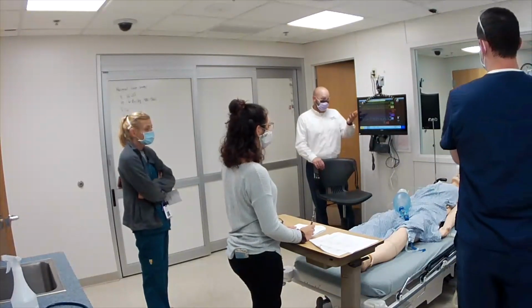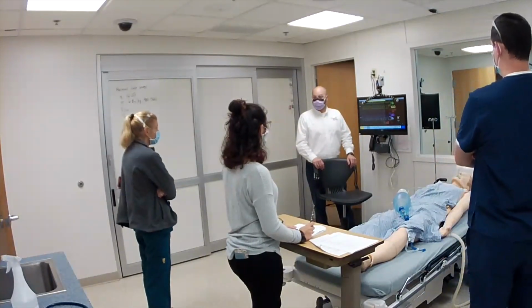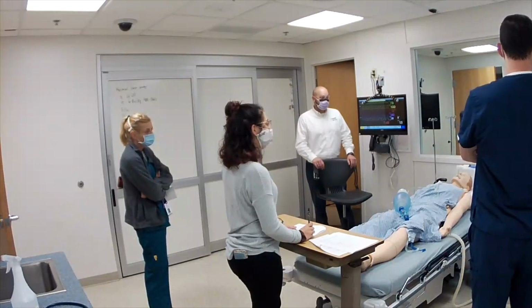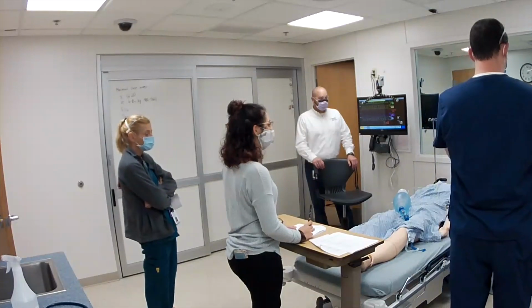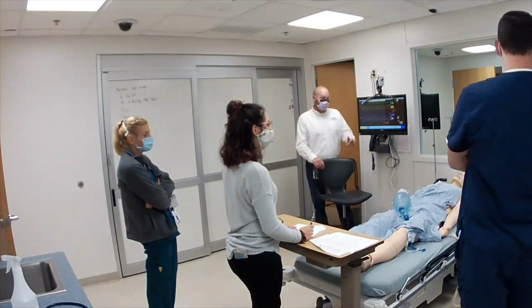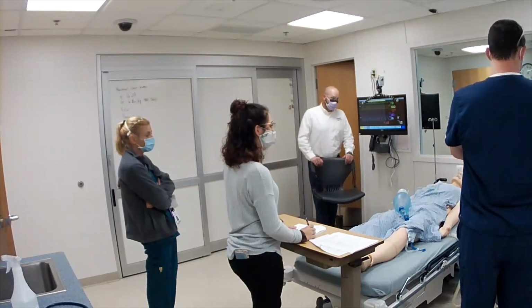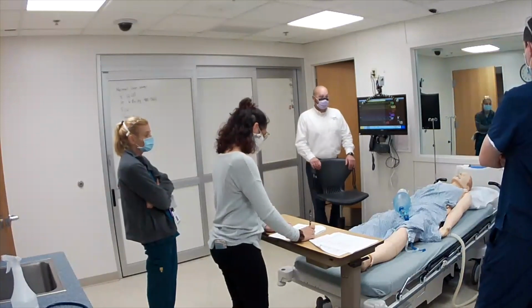Perfect. What's next? The I:E. Okay, we set that, but that's what we're seeing there. It's measuring it for us. Okay, so what's the next one? Minute volume. So MVE, right? Minute volume expired. So what is that telling us? The amount of air that we have given in a minute.